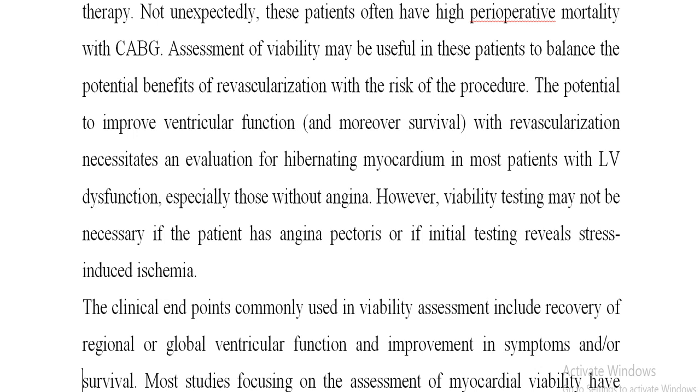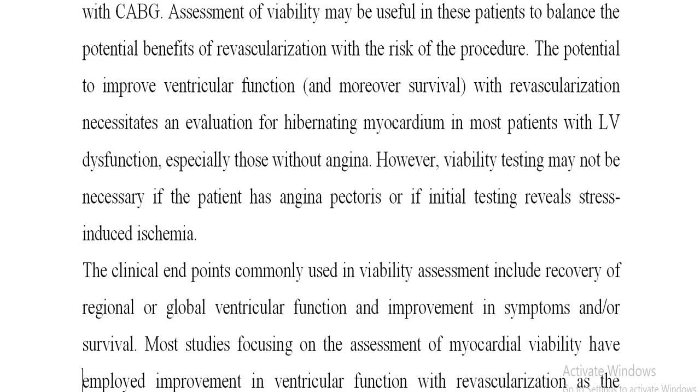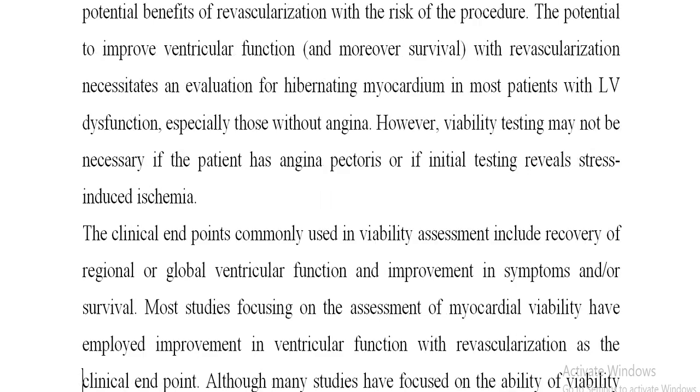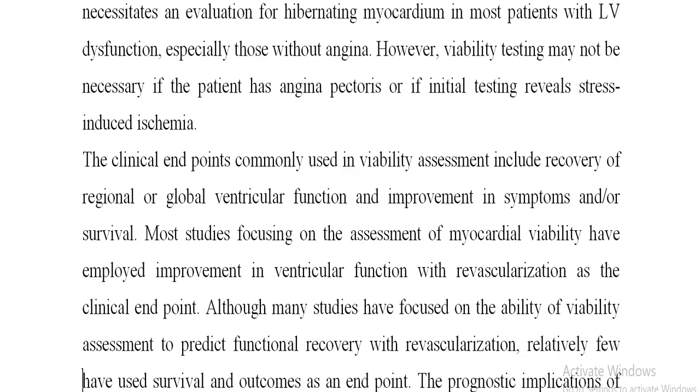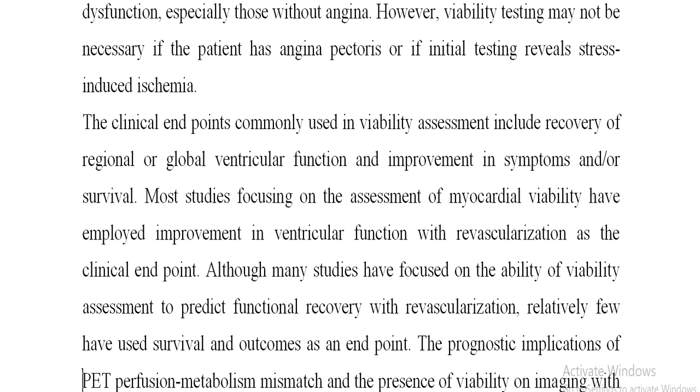The clinical endpoints commonly used in viability assessment include recovery of regional or global ventricular function and improvement in symptoms and/or survival. Most studies focusing on the assessment of myocardial viability have employed improvement in ventricular function with revascularization as the clinical endpoint. Although many studies have focused on the ability of viability assessment to predict functional recovery with revascularization, relatively few have used survival and outcomes as an endpoint.